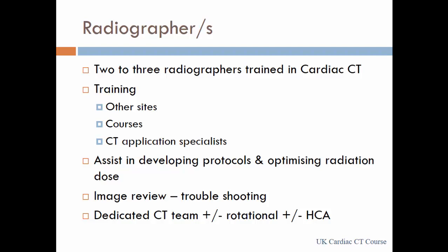Now, they are very important in terms of developing the protocols and optimizing radiation dose, because they are the ones who are actually doing the scans. Their buy-in is very important. Their buy-in to the whole service is very important, because unless you have a team of motivated radiographers, you're not going to get the scans done in the first place.